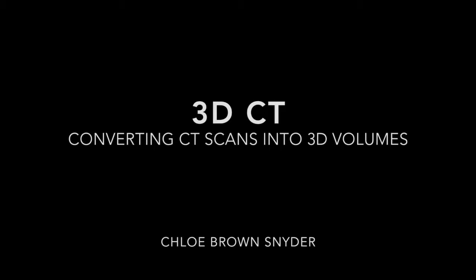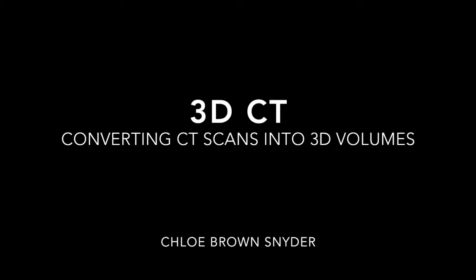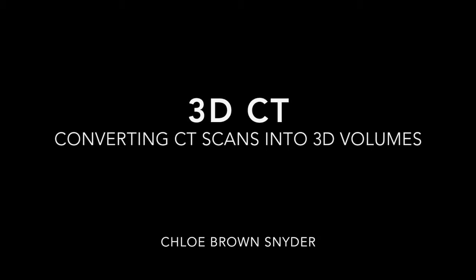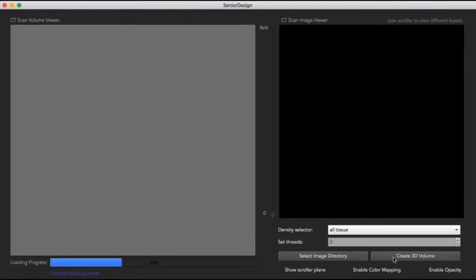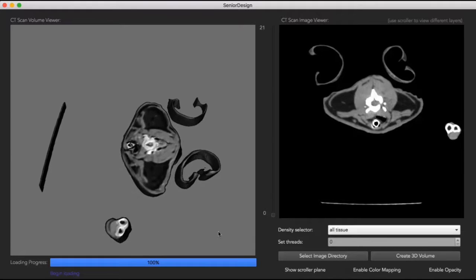My senior design project was to take in CT scans and turn them into a 3D volume. I accomplished this using the Marching Cubes algorithm. For a set of images, I iterate over the images and calculate the alpha value of each pixel. The alpha value of each pixel represents the density of the tissue at that point. I calculate the alpha value by summing R plus G plus B divided by 3, and using this alpha value to represent the density of the tissue at that point.